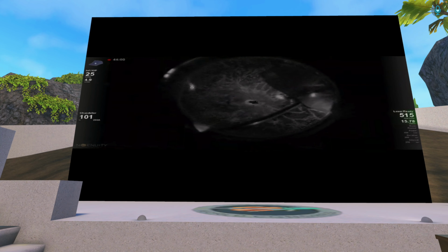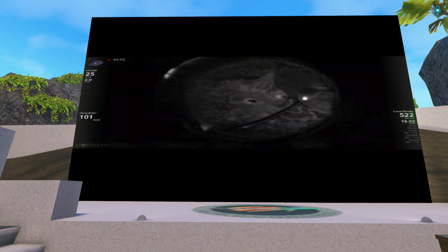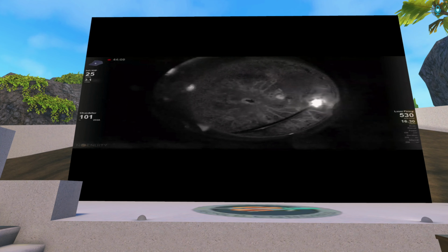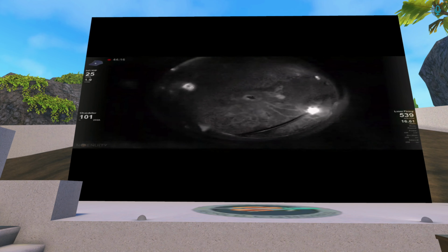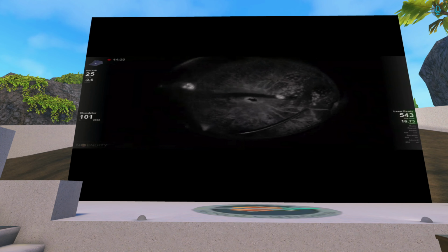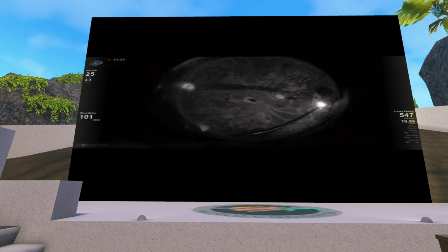Of course, I agree that we need to see the retina in order to work safely, but the aim of intraop FFA is actually to evaluate the vascular network of the eye. And I agree, black versus white is the highest contrast you could get. So why wouldn't you use it?